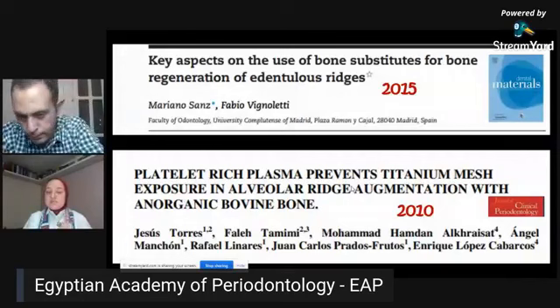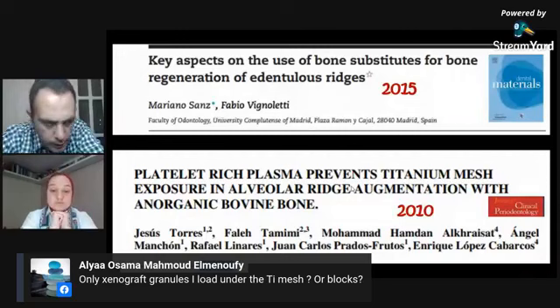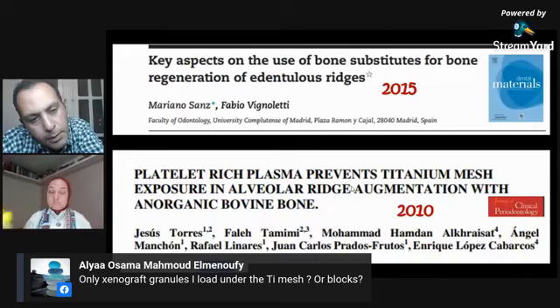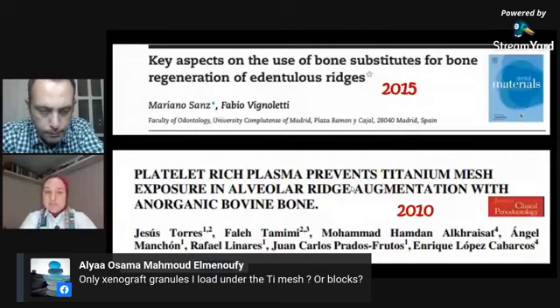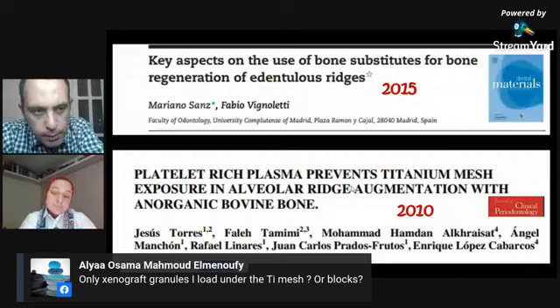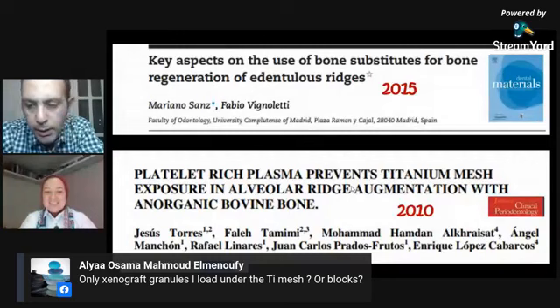Sorry, doctor, we have a question here. Sure. It's from Alia Usama Mahmoud El Menoufi, and she's asking about only xenograft granules loaded under the titanium mesh or blocks. Yes, this is what I was saying in this slide. We only used xenograft, and we didn't use a mixture of xenograft and autograft. Maybe she's not asking about the study. She's asking in general, can we add blocks under the titanium mesh?